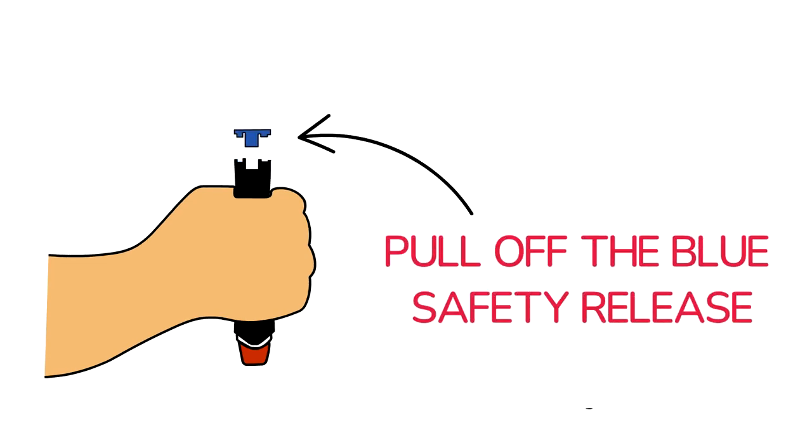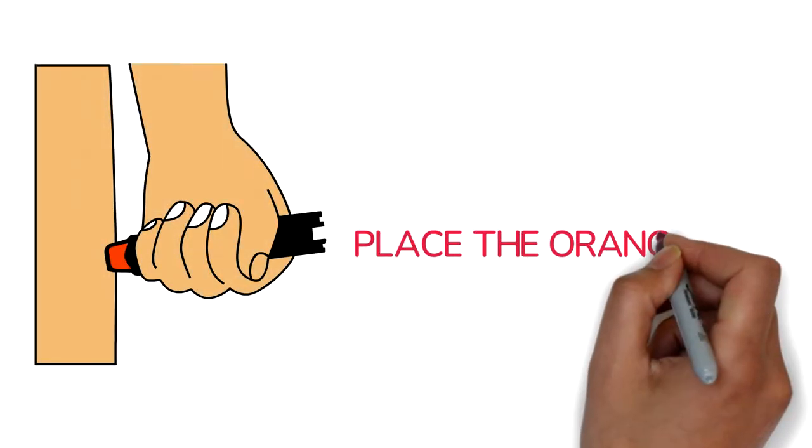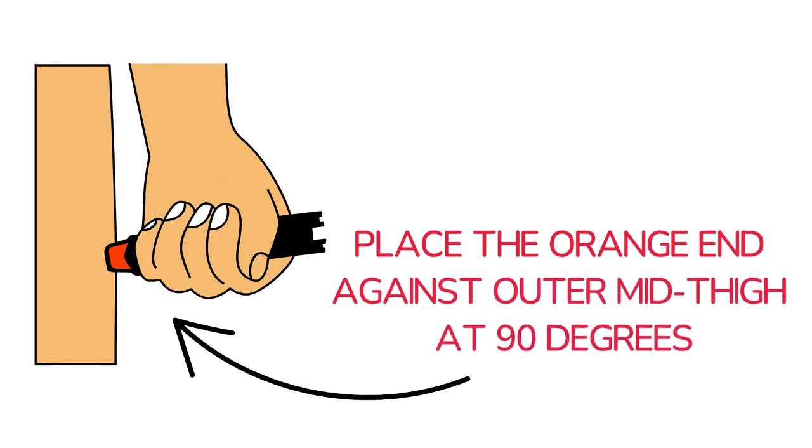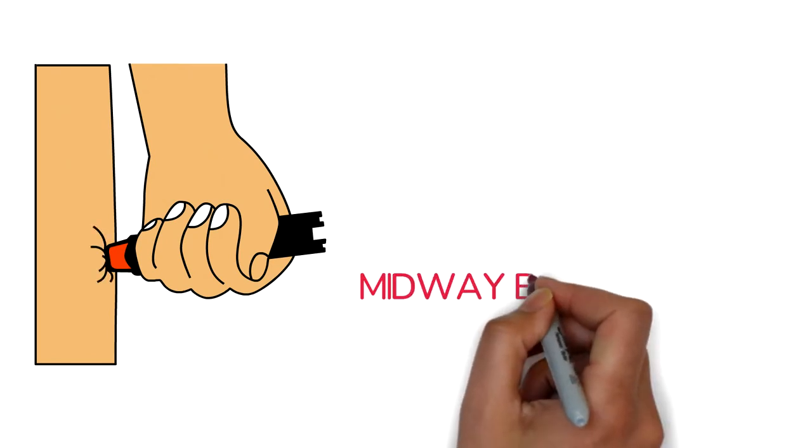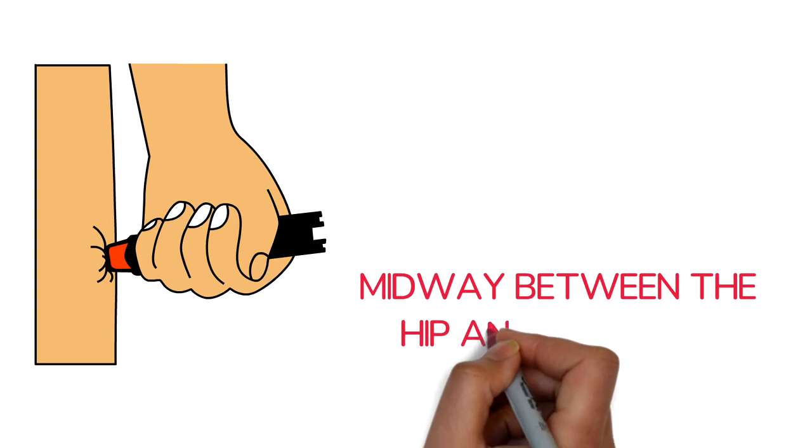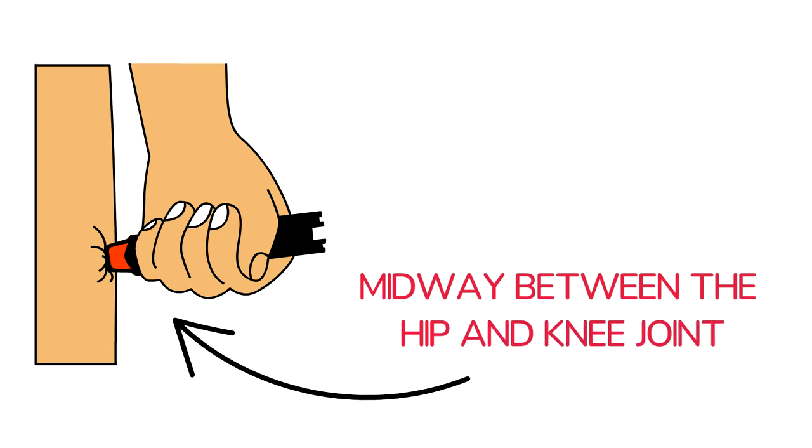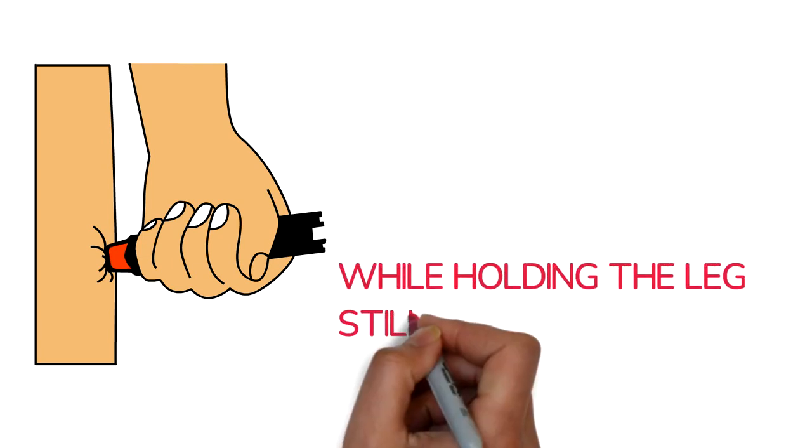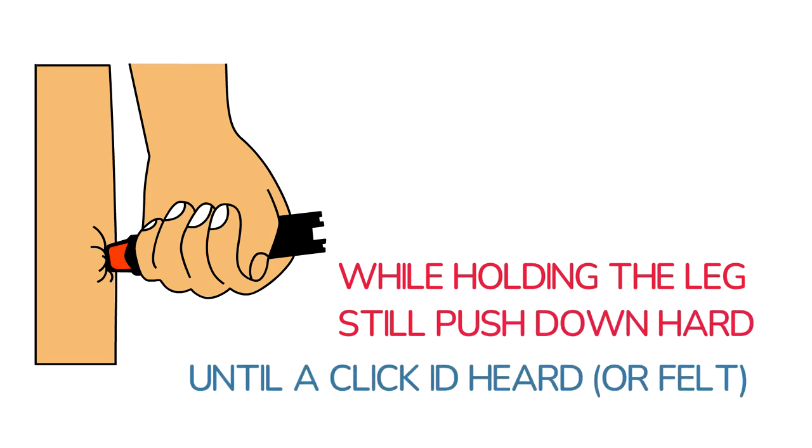Place the orange end firmly against the middle of the outer thigh. The EpiPen works through a single layer of clothing, but not through pockets or seams. Push the EpiPen down onto the thigh until you hear a click.